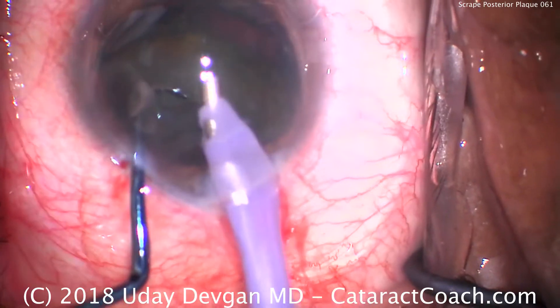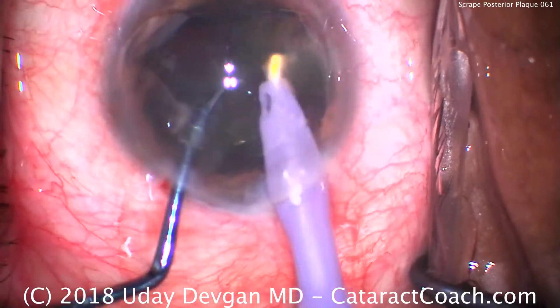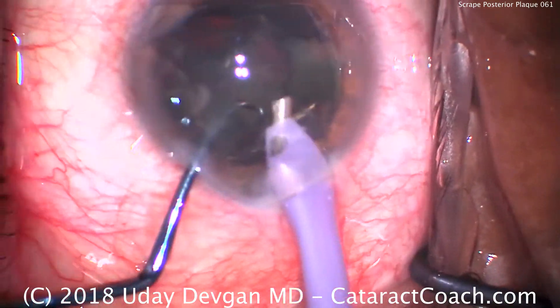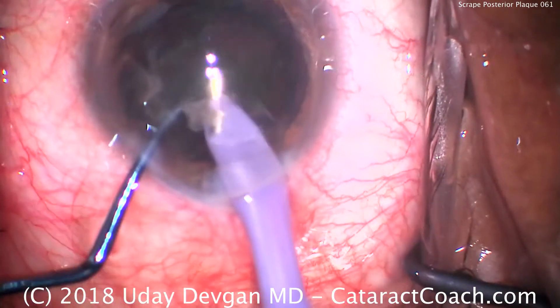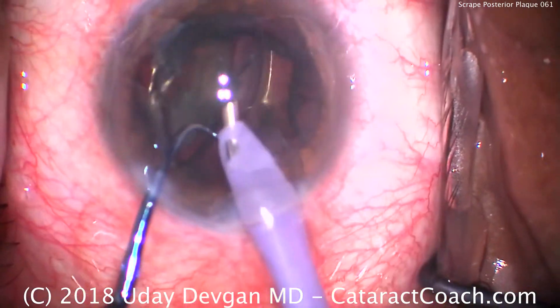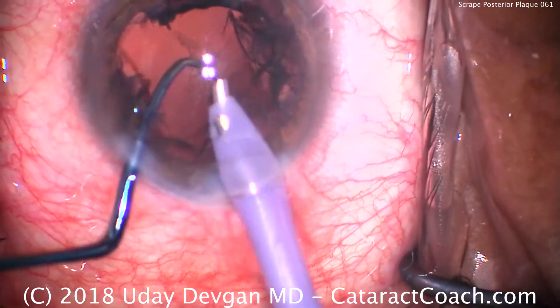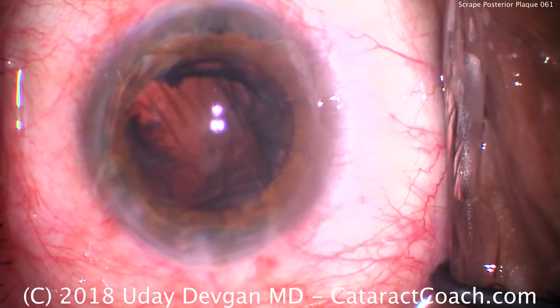We emulsify the pieces that are there, operating at about the iris plane — not near the corneal endothelium. That's a big differentiation, a very important point. Removing the remainder of the lens nucleus, and just like that, we're done with nucleus removal.